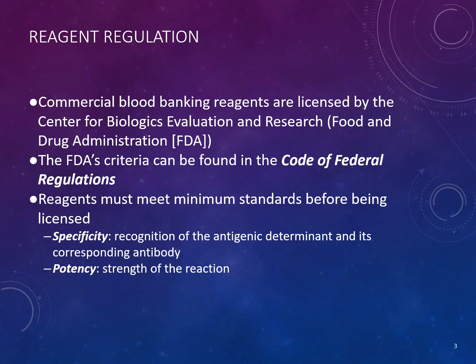Now, reagents do follow regulations, just like blood bank. Anytime there's any kind of manufacturing of any sort of blood product, whether it is a reagent or an actual unit of blood, platelets, fresh frozen plasma, anything like that, it requires that it go through an FDA process of regulation and approval. Since it is something that is actually infused to the patient, it's considered a drug. That's why the reagents associated with that testing follow the FDA protocols as well.